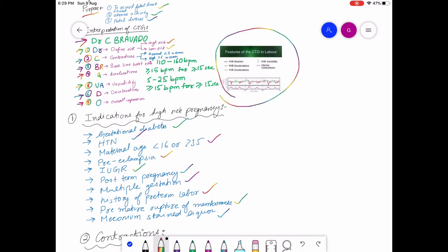Now let me explain the CTG strip diagram. There is an upper box and a lower box. The upper box is for the fetal heart rate, and the lower box is for the uterine contractions.